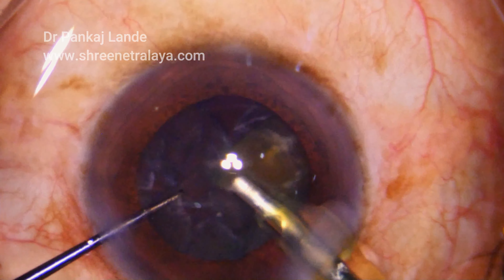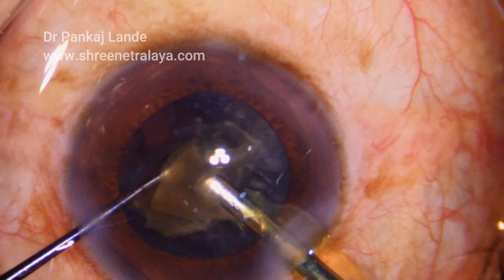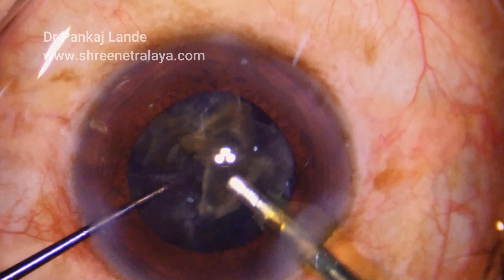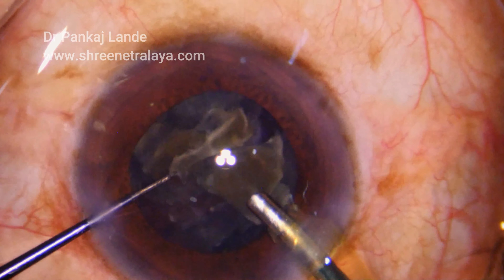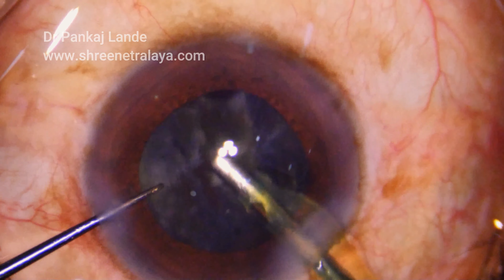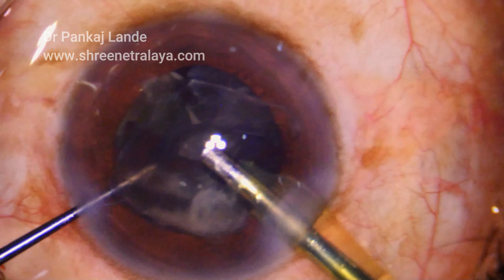I hope this technique will help a lot of surgeons and benefit patients. The beauty of this technique is you can use your existing phaco machine — just attach the tip to it and start using your ultrasonic pre-chopper.